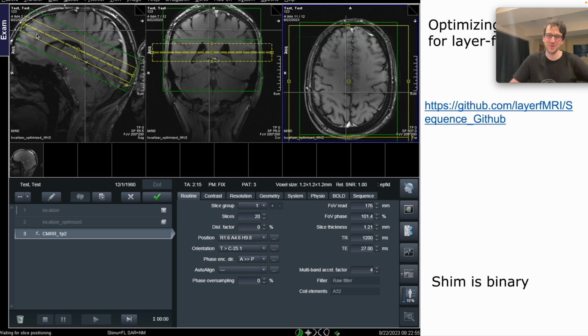but not more than 60 hertz, because ultimately most of the reconstruction calibrations are still happening in K-space or projection space. So we cannot really sacrifice the front entirely. What I mean by that is that areas up there are still relevant to get good reconstructions back there. Specifically, for example, GRAPPA is happening in K-space, right? If you have very bad calibration in the front, you have a bad GRAPPA kernel, and that GRAPPA kernel is applied everywhere in K-space, so also in the back of the brain you have a GRAPPA problem.